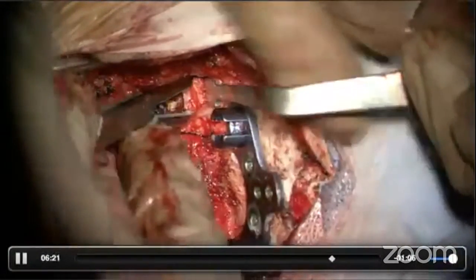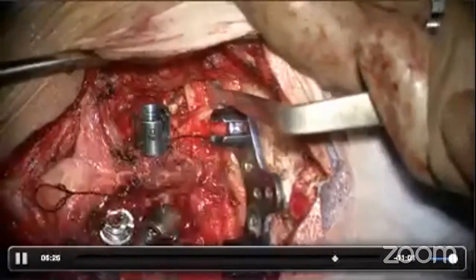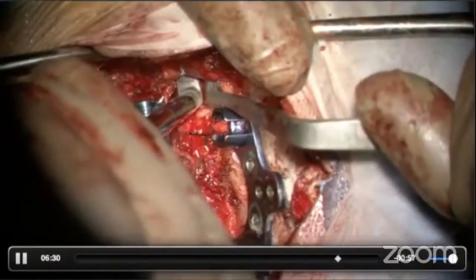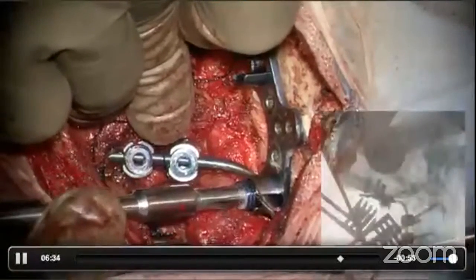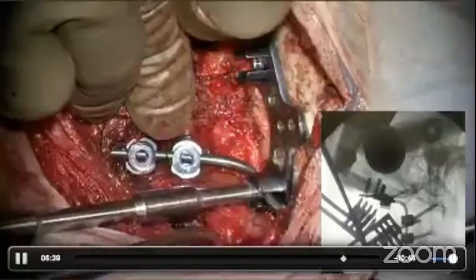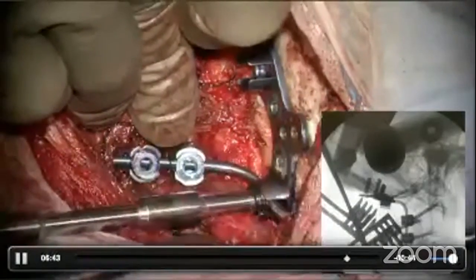If reduction of basilar invagination is required, which is not the case here, then the joint can be distracted using Goel's cages. Finally, the rods are locked in place. In this patient, the reduction was achieved with position and traction, hence much manipulation over the rods was not necessary.